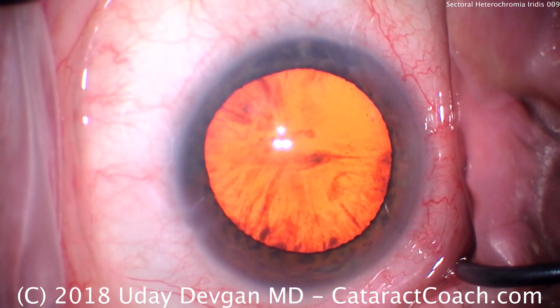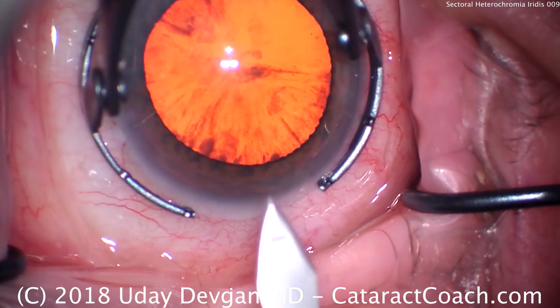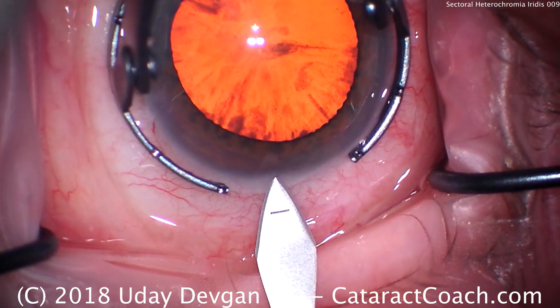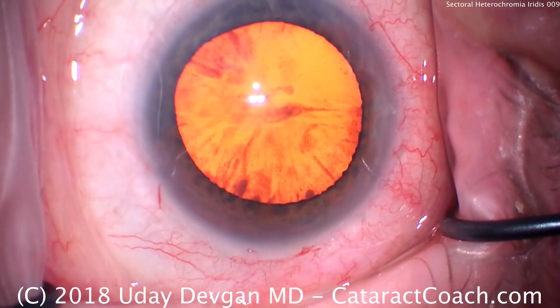Installation of viscoelastic was done there. Now it's time for our temporal incision. Fixation ring to hold the eye, and we'll do a single plane incision here, just where those limbal vessels end at the cornea.